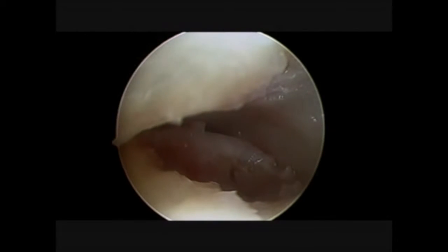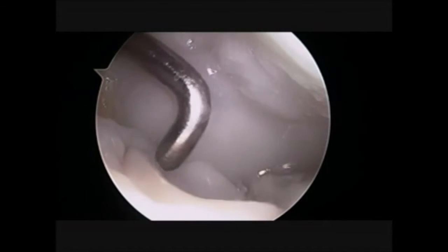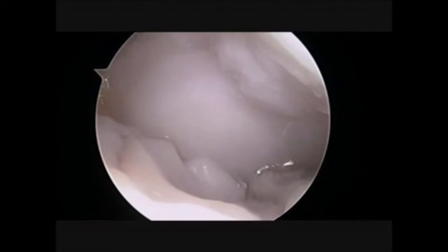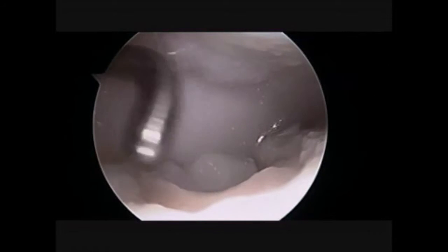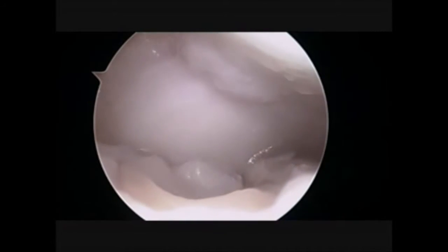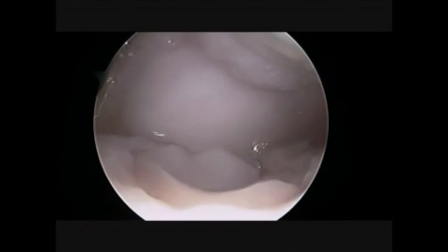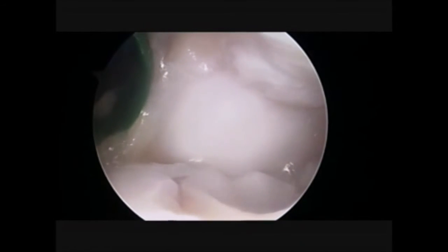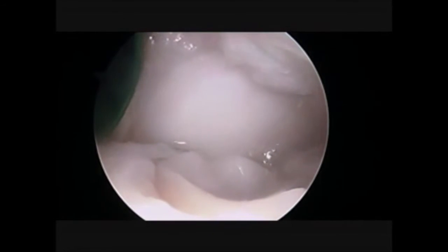We are ready to study the shape of the lesion. We use an aluminum template to get the right dimensions, and once we have it we are ready to implant the final membrane. Here we are implanting the final AMIC Chondroguide membrane in the joint. As you can see, we use a shoulder cannula in order to introduce both the aluminum template and the final membrane.